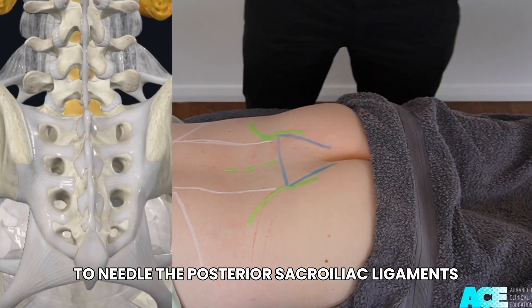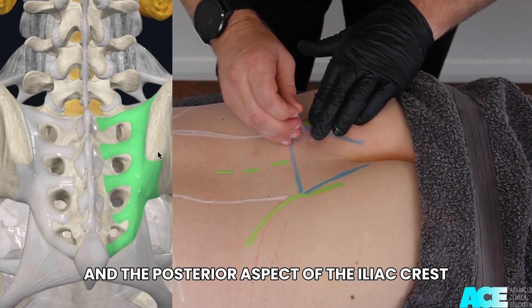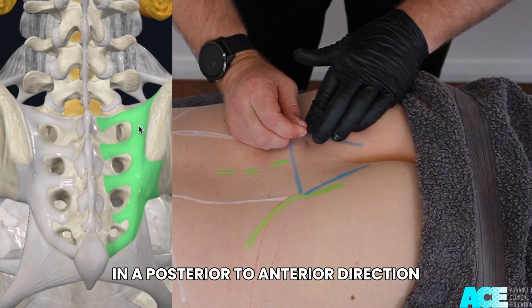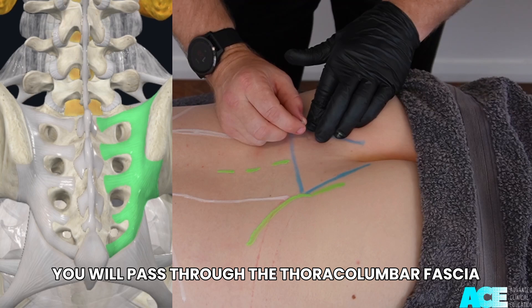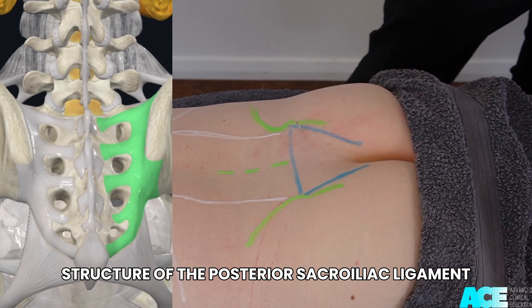To needle the posterior sacroiliac ligaments, identify the location of the PSIS and the posterior aspect of the iliac crest. Roll over the edge of the iliac crest and insert your needle in a posterior to anterior direction, slightly laterally directed. You will pass through the thoracolumbar fascia and then into the dense ligamentous structure of the posterior sacroiliac ligament.